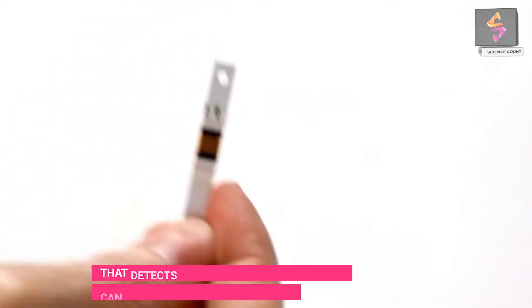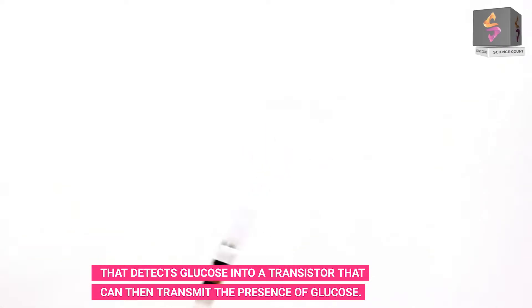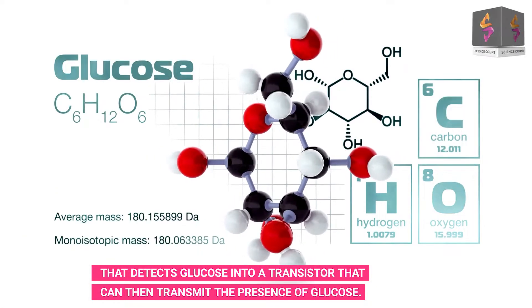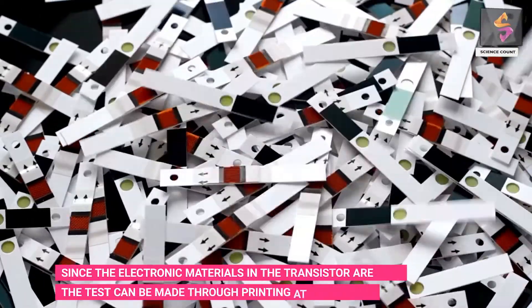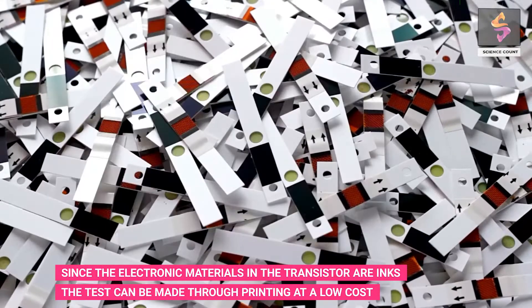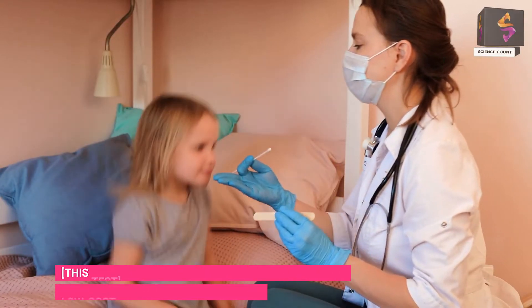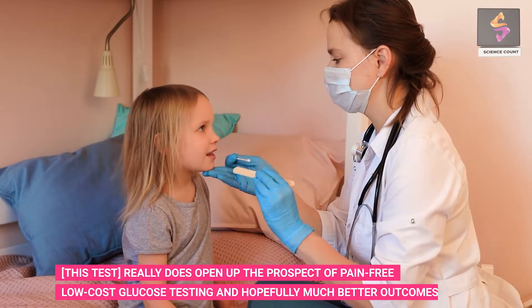This latest test works by embedding an enzyme that detects glucose into a transistor, which can then transmit the presence of glucose. Since the electronic materials in the transistors are inks, the test can be manufactured through printing at a low cost.